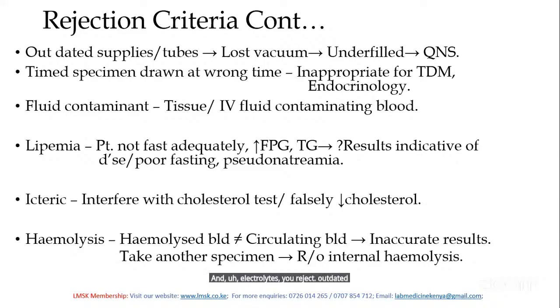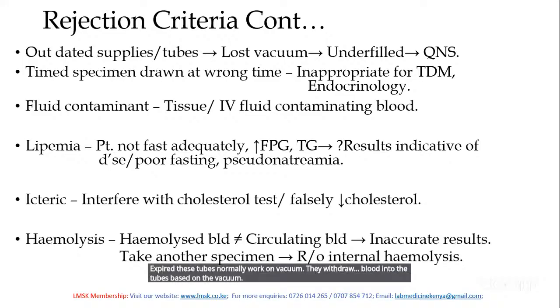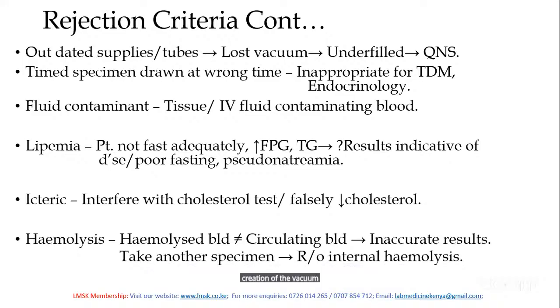Outdated supplies. What has expired? For instance, the tubes. These tubes normally work on vacuum. They withdraw blood into the tubes based on the creation of the vacuum. The blood is aspirated inside.